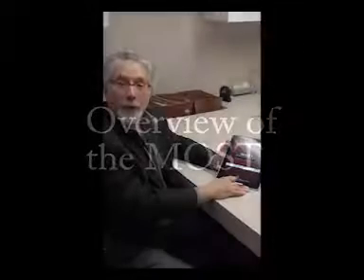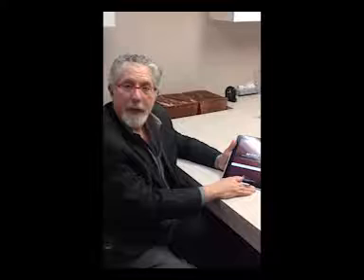Hi, this is Dr. Mitchell Kleonsky, and I'd like to introduce you to the iPad version of the Memory Orientation Screening Test, or as we call it, the MOST. The MOST is a 29-point test which is capable of giving us very high degrees of accuracy in terms of a patient's cognitive level, which will lead us to understanding what next to do in their treatment.